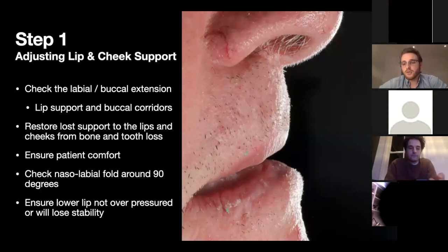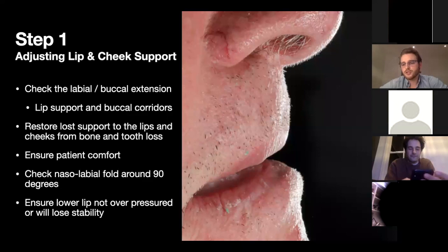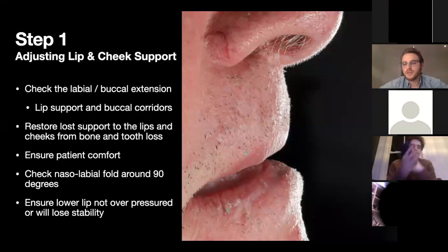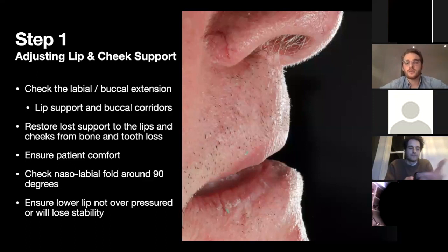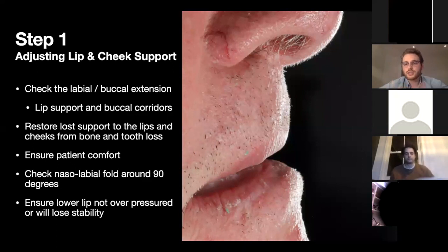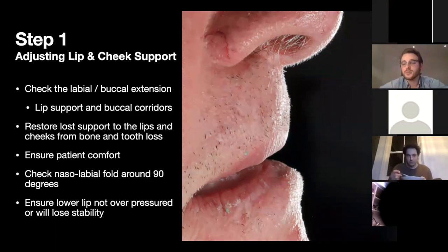I break it down into six steps. The first thing I always check is adjusting the lip and cheek support, checking both upper and lower for good labial and buccal extension. The wax rim determines where the outer facing surface of the teeth will be — the labial of the front teeth and the buccal of the posterior teeth. You need to make sure you're not pressing too far into the lips but you are supporting them, and also look at the buccal corridor — the space between the teeth and cheeks when you smile.